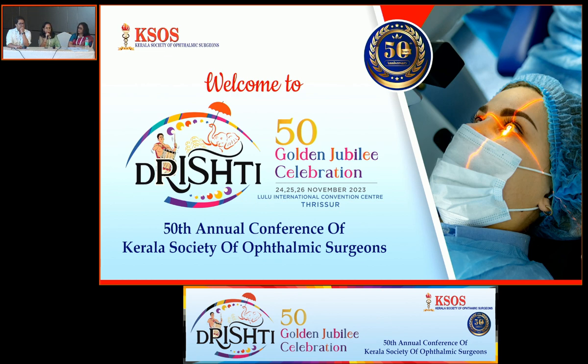Once you master gonioscopy with the coupling lens, then it's better to go with the non-coupling one, not only for indentation: you get a Goldmann two-mirror lens without the coupling gel. When you have a busy OPD setup, it's not always practical to use visco and then clean it off. Patients will also feel better when gonioscopy is done without any visco. That will make it smoother.